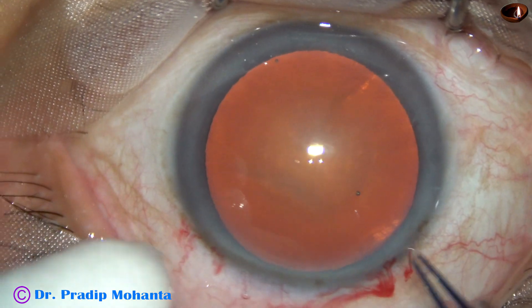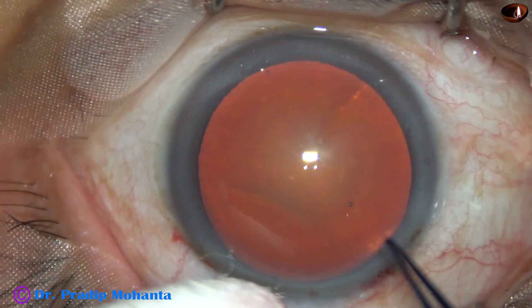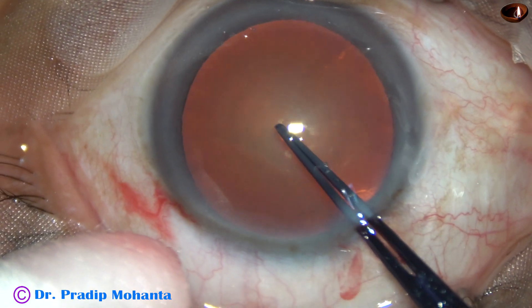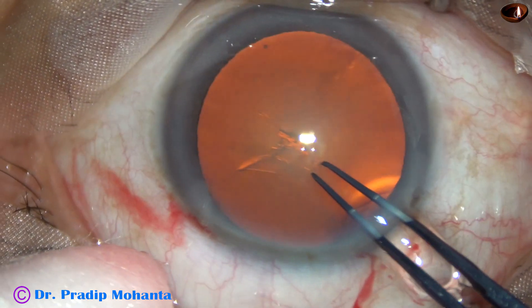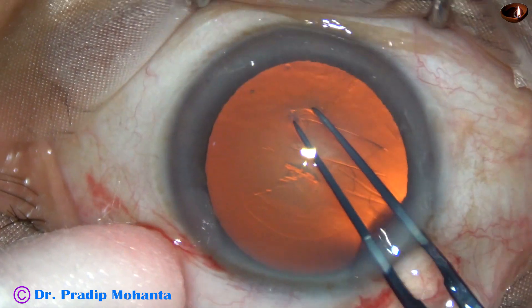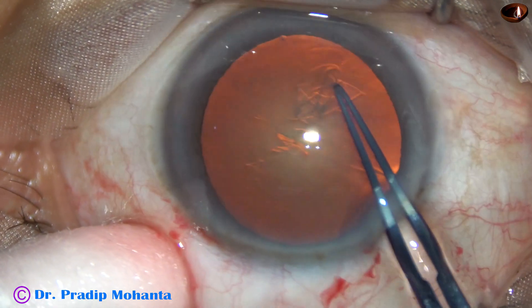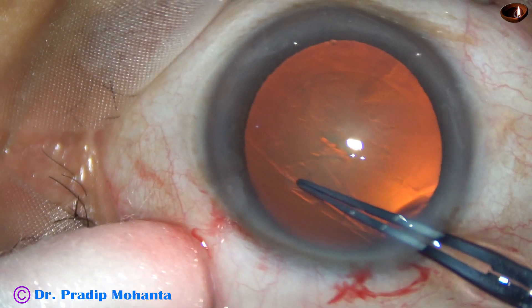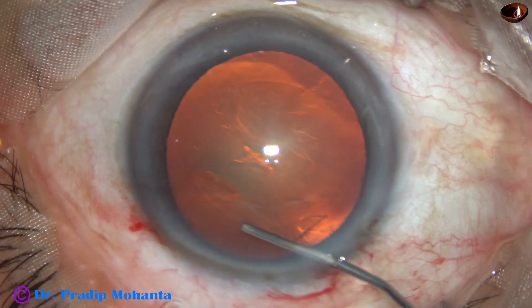And now, capsulorhexis by the utrata forceps. The utrata forceps is introduced into the anterior chamber, presses on the capsule, and a capsular tag is raised. This capsular tag is held with the utrata, and it is my habit to go anticlockwise. An adequate sized capsulorhexis has been performed.